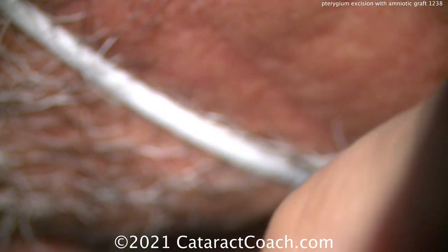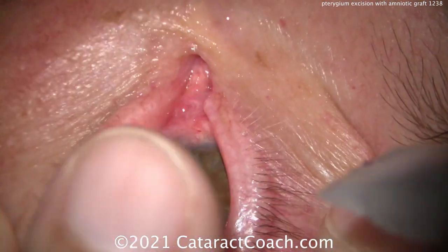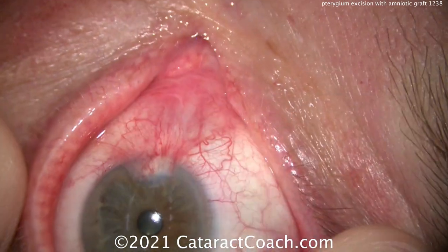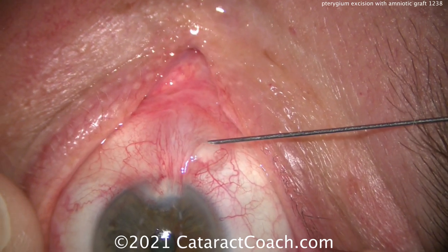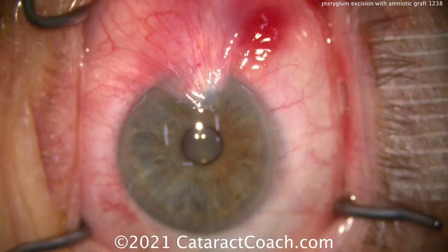At the beginning of the case, we get some tetracaine and we're going to put that on a Wexcel sponge, and we're going to hold that over the pterygium. The patient's eye has not been prepped yet — this is before we do any surgical prep, before the drapes go on. We numb it up with a tetracaine-soaked sponge, and then we can put in some lidocaine with epinephrine and inject that into the lesion, into the pterygium.